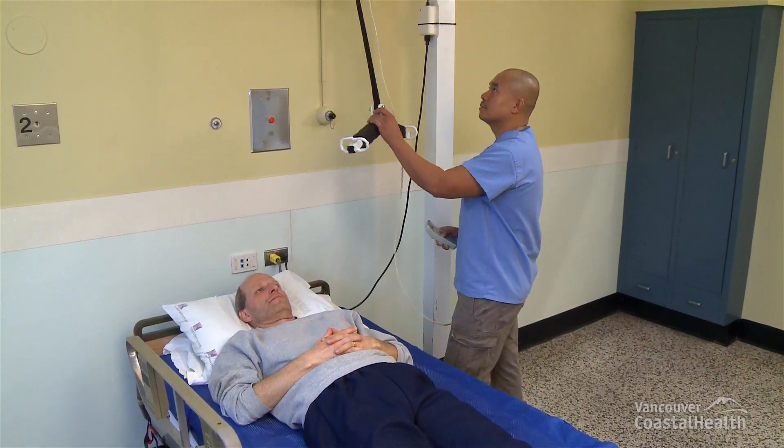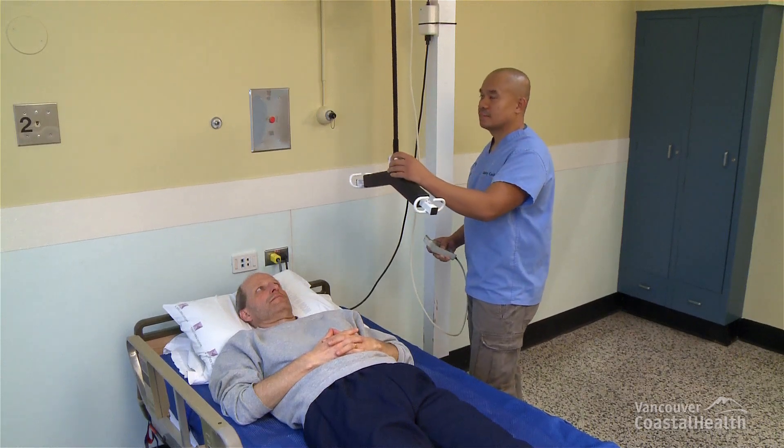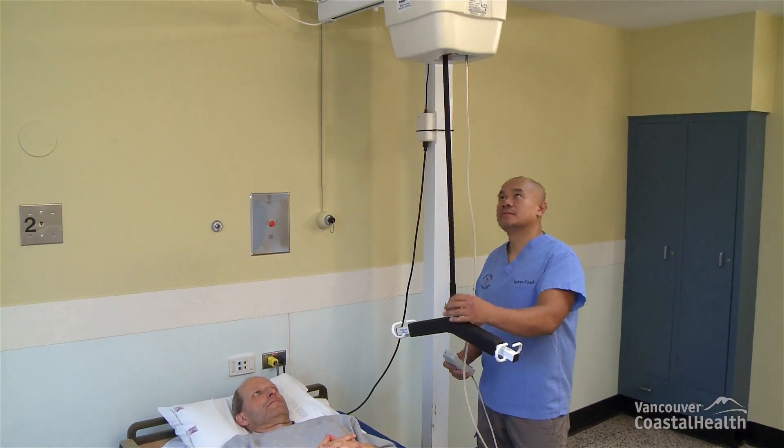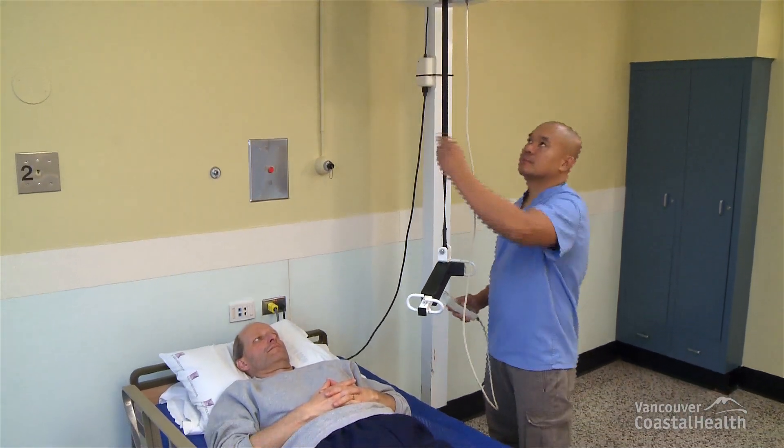Quickly check the lift for any visible damage. For example, is the black belt attached to the carry bar frayed? Is the black belt twisted and requires straightening? Is the handset functioning properly? Is the motor battery sufficiently charged?